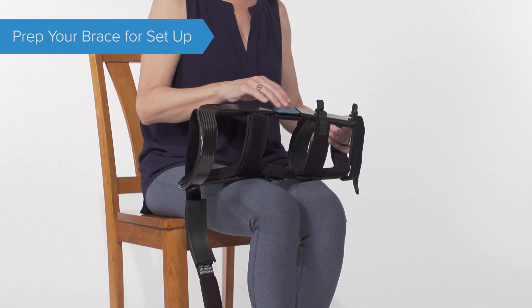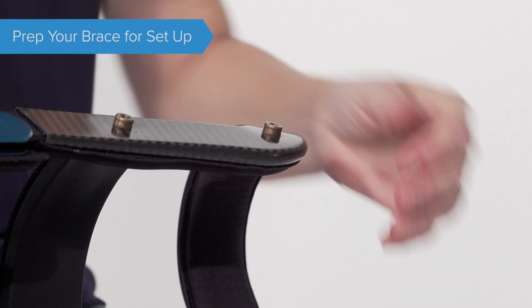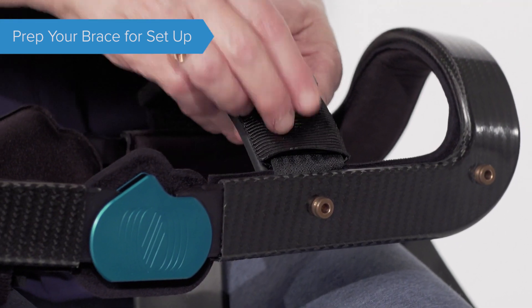These clips will only release when being pulled straight out. Loosen the tensioning knob on the back of strap 3. To do this, pull the knob straight out until you hear an audible click.